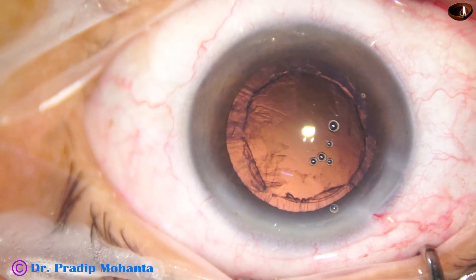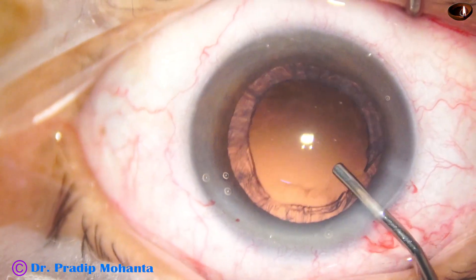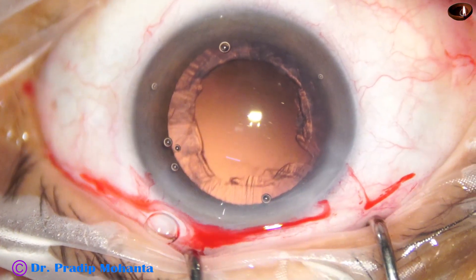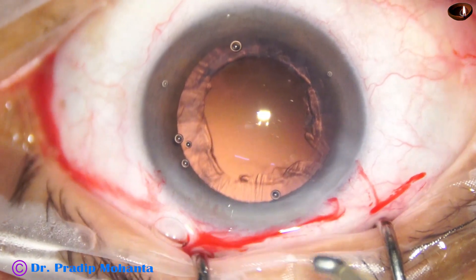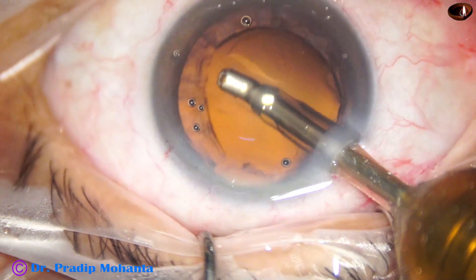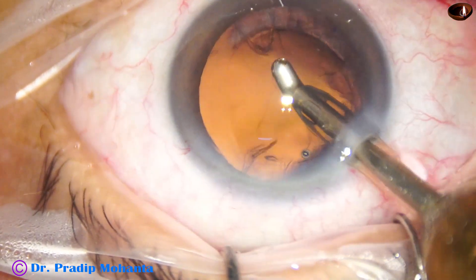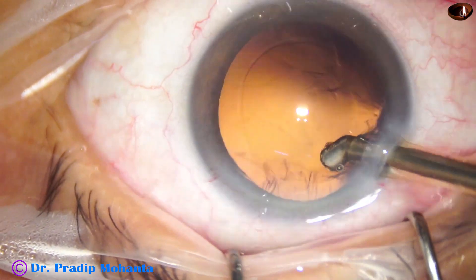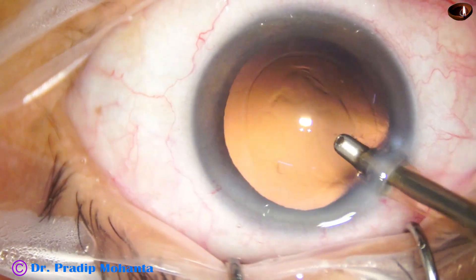There is a lot of cortex in this case. The capsular bag and the anterior chamber are filled with visco. I'm going to use coaxial irrigation-aspiration — the tip goes in, holds the anterior part of the cortex, pulls centrally, and aspirates.